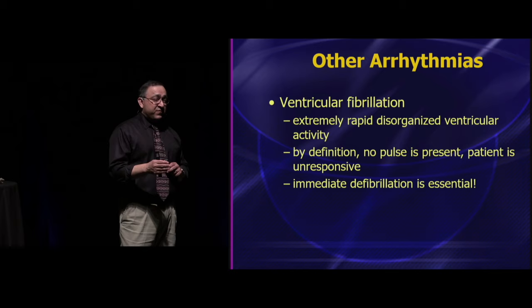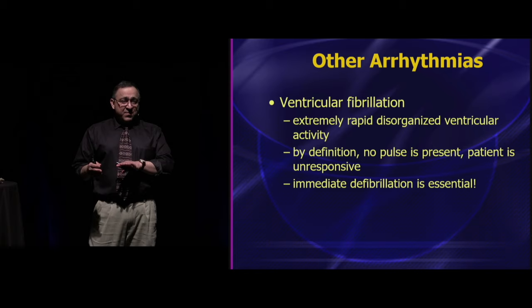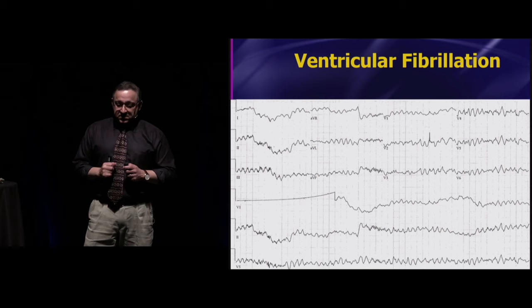All right? So hopefully they're on the monitor. Don't waste time doing CPR. Definitely do CPR until the monitor and defibrillator are ready, but as soon as that defibrillator is ready, you get people out of the way and you shock them as quick as possible. All right? And there's, of course, your VFib.